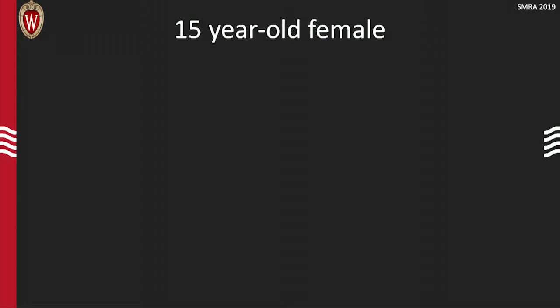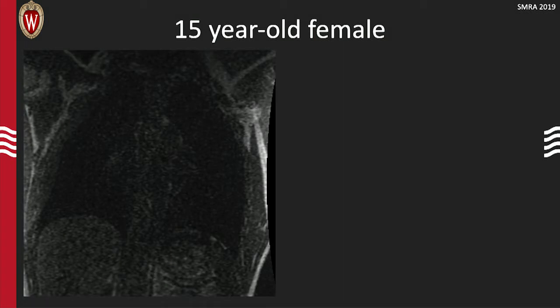So when do we use MRA for PE? The most common indication, really the first indication, and the way we got it started, is we looked at it as a way of avoiding any unnecessary radiation in young patients, and specifically young female patients. And so, similar to the increasing interest and use of MRI to detect appendicitis, we approached the ED and said, why don't we use a similar philosophy to approach our young patients who we think might have PE.